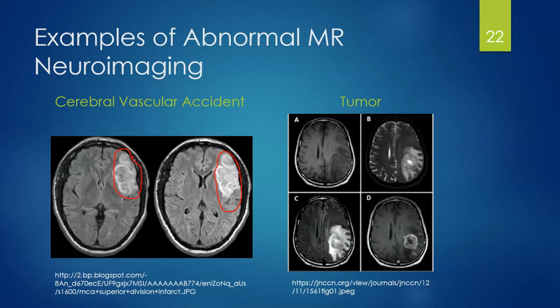Down to, we look at something and we find something like a tumor. Through various sequences, we can once again manipulate fat versus fatty tissue versus water-based tissues to see whether or not we have something that is cytotoxic edema or ischemia in the tissues.